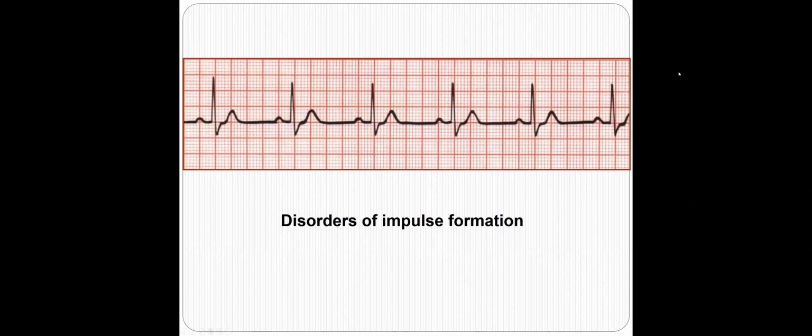Yes, doctor. Well, arrhythmia literally means abnormal rhythm of the heart. Okay, so it means that you are talking about how the RR intervals are coming. So whether they are coming in a regular interval or not. This is one thing. So when we talk about rhythm, one thing is that the RR intervals are the same. What else?